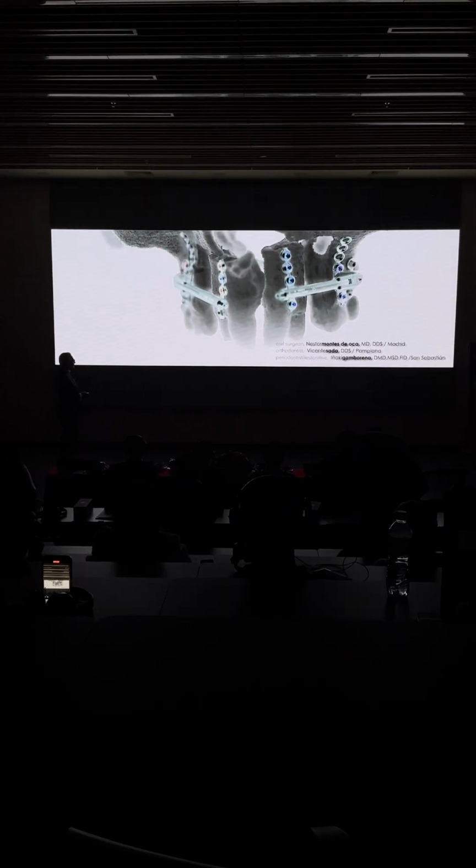And today, with printing the CBCTs, the surgeon can really have a good idea about where to place his screws, avoiding the roots and bringing the pieces together, bringing the segmental osteotomy forward, and bringing the canine next to a lateral incisor, a premolar on the lateral incisor. So you will see what problems I have to deal with.